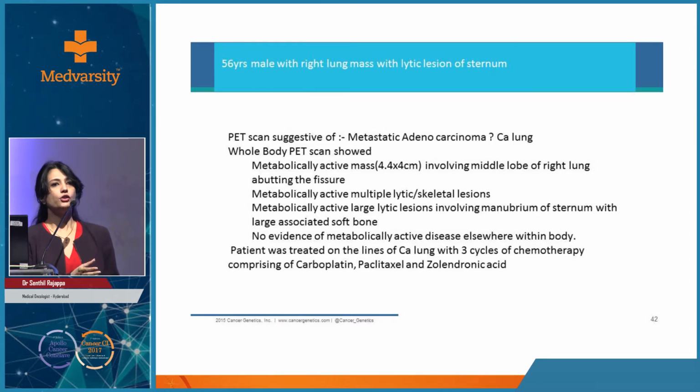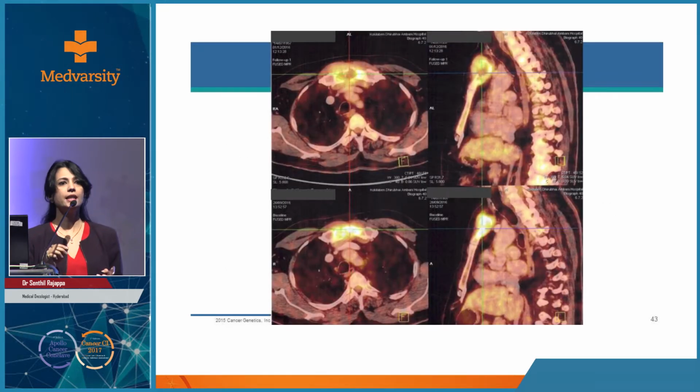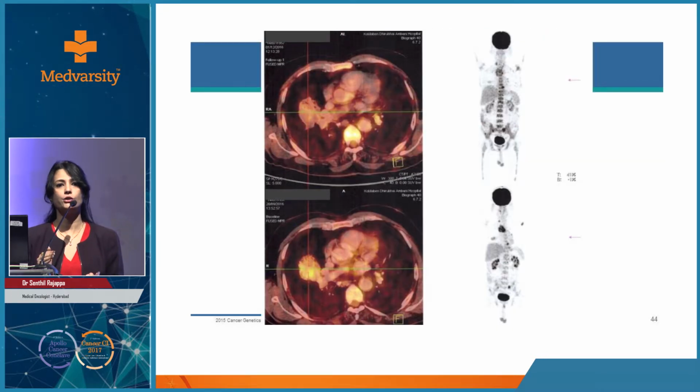When you take a tumor sample, you perform gene expression profile, and you basically compare the gene expression profile of your patient's tumor sample to the bank of gene expression profiles, the library that the company already has, which basically classifies or compares it into 15 different tumor types and gives it a number. The number is called Similarity Score.